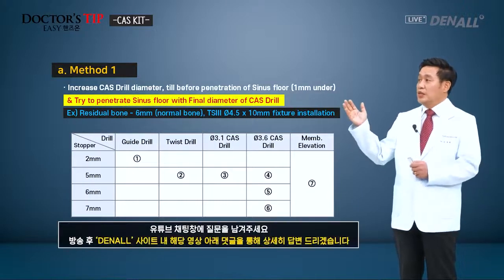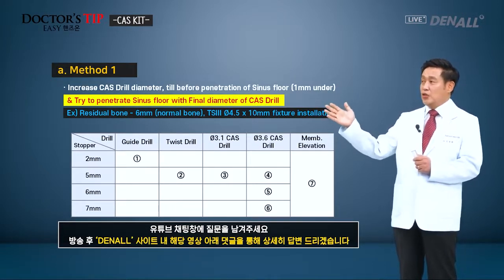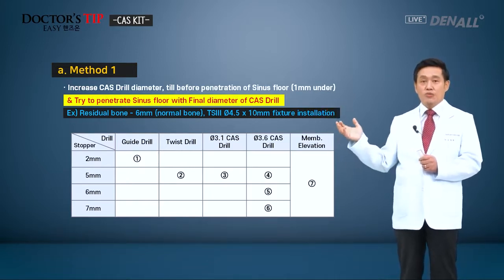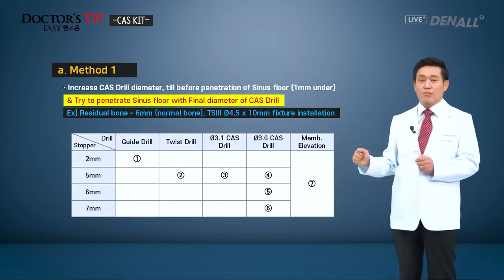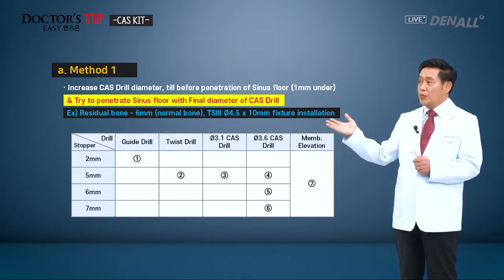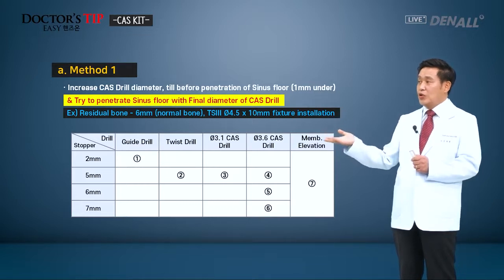The first method: before we penetrate into the sinus floor, CAS drill diameters are increased step by step. And the last one, fitting the fixture diameter, the thickest diameter drill is used to penetrate into the sinus floor to minimize the sinus membrane damage. A thicker CAS drill would be used to penetrate into the sinus floor without damaging the sinus membrane.